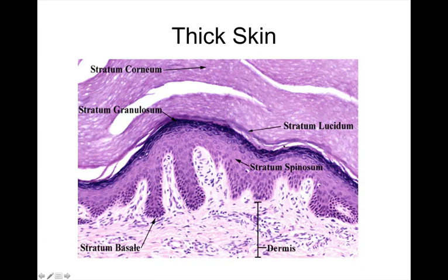It's a thin layer. And then there's the stratum granulosum, which is a few cell layers, and those are more darkly stained than the others. And the stratum spinosum, for me, I just recognize that as being the layer that's right above the basal layer. And then the stratum basale is lining the dermis.